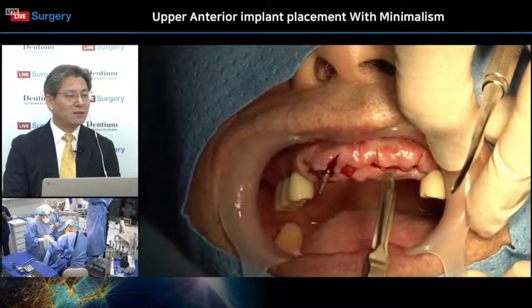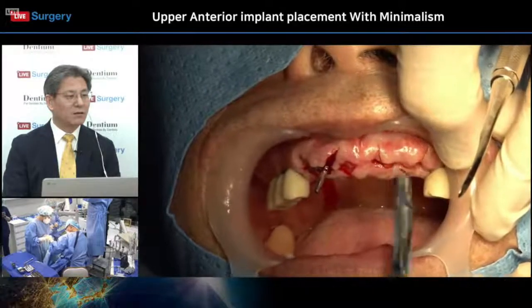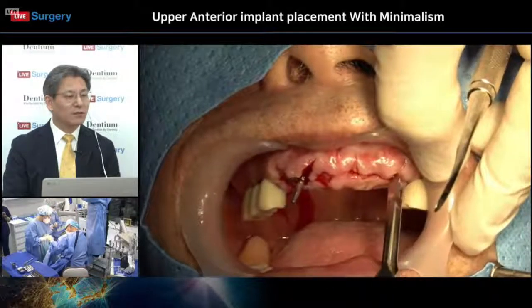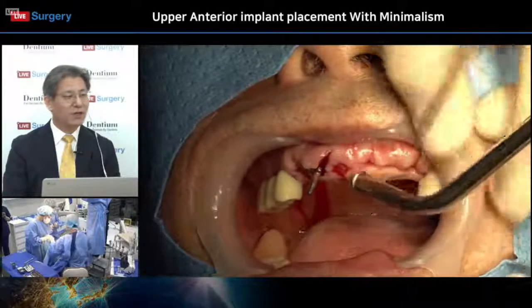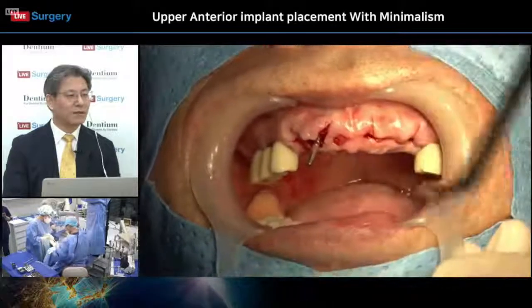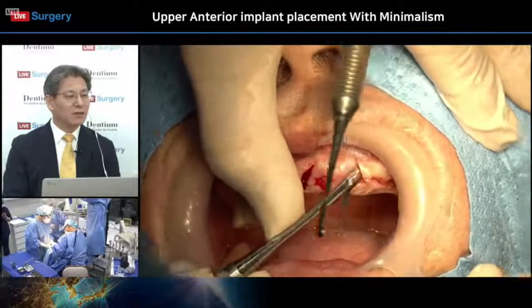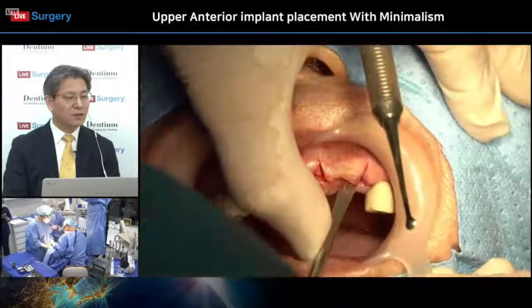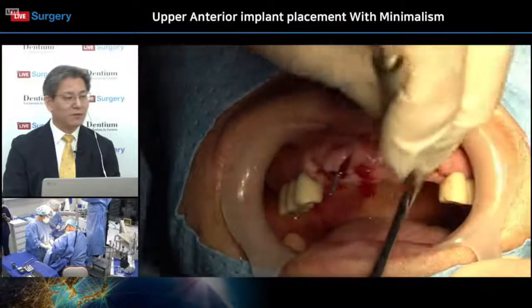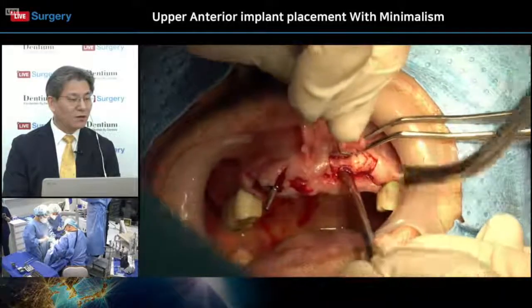Little bit wider incisions made, about number 22, and from the 22 until the number 23 area. The crestal incision and two vertical incisions are already done, and using this periosteal elevator for the flap raising, and raise the flap. And already raised the flap.